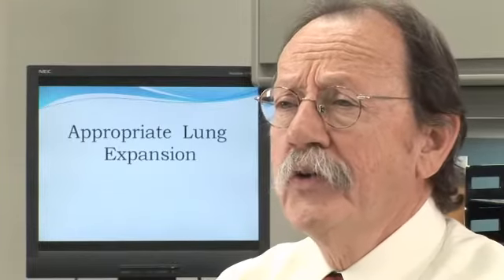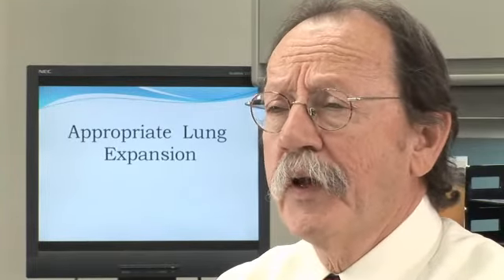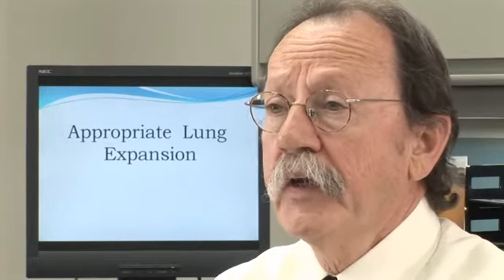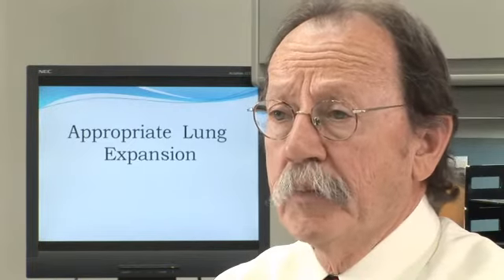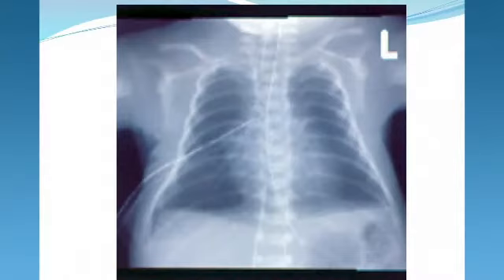The key for using high frequency is to achieve appropriate lung expansion. You want the lung to get uniformly inflated because if you are going to adequately ventilate the patient, the lung has to be open, because that's how gas is exchanged, because you don't make big changes in the airways like you might with a conventional ventilator. And if you get overdistended, as this X-ray shows, that will be lung injurious and that will worsen pulmonary hypertension. So avoiding lung overinflation is as important as avoiding lung underinflation.